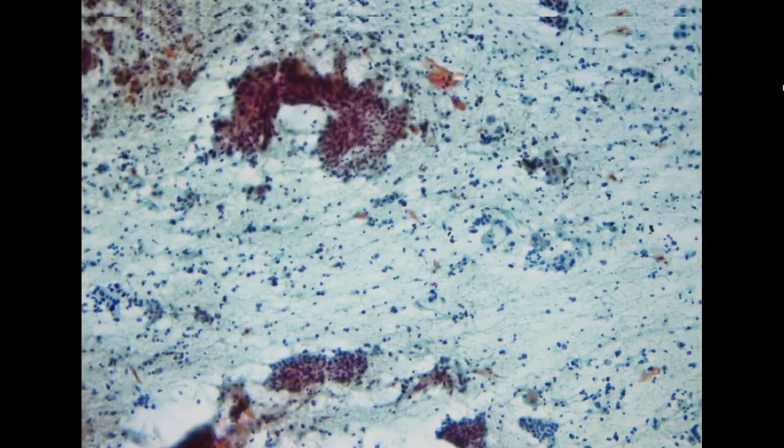For this atrophic specimen, due to the keratinized cells with nuclear atypia and more blood than usual in the background, we are going to call this ASC-US. This is why we use ASC-US in a different scenario: when we see an atrophic smear but also striking nuclear atypia, particularly in the superficial cells, we can still use the category ASC-US.